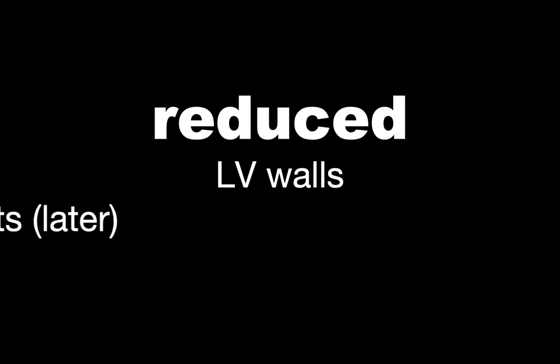So we'll talk now about what reduced function looks like. Again, pay attention to those LV walls. You'll notice that they don't appear to get thick with every beat, and the actual cavity of the LV doesn't get smaller every time the heart beats.